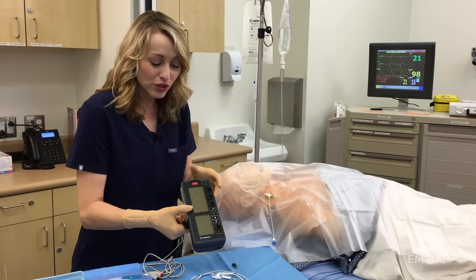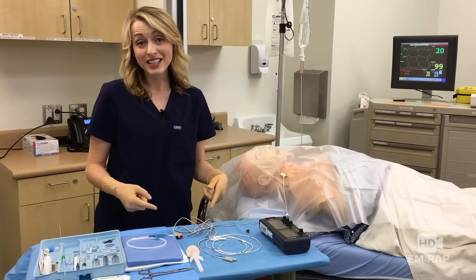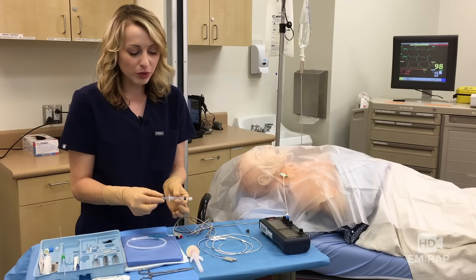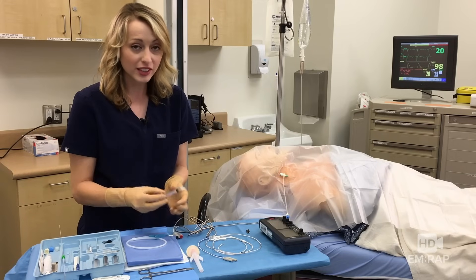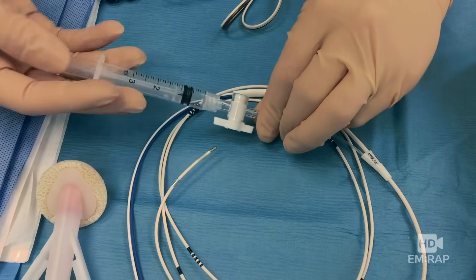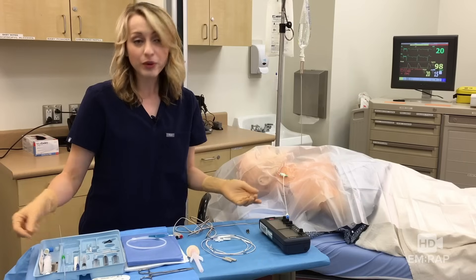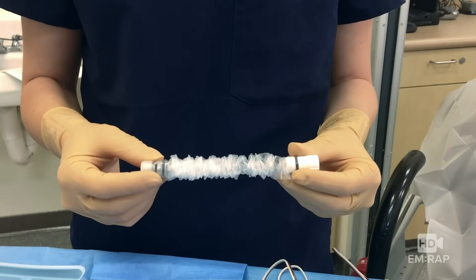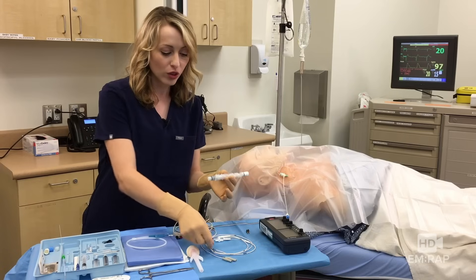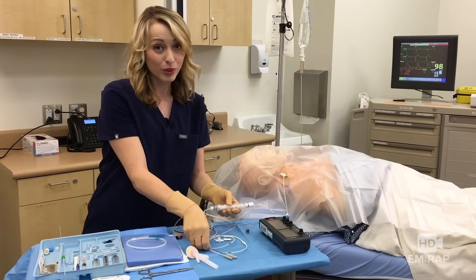Ours can actually be atrial or ventricularly paced, but we're putting this in the RV, so plug it into the V. Now that the connecting cable is all set up, check the balloon on our pacing wire and make sure it works. Use the small syringe — it can't draw up more air than it allows, which prevents rupturing the balloon. Confirm the balloon inflates, then deflate it, keep the stopcock open, and use the sterile sleeve. The sterile sleeve direction really matters: this side connects to the cordis, so the wire has to feed through it in the correct direction.